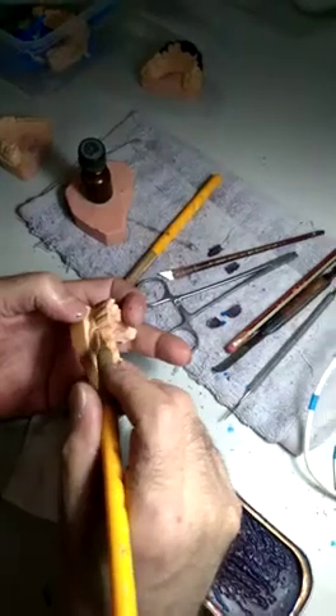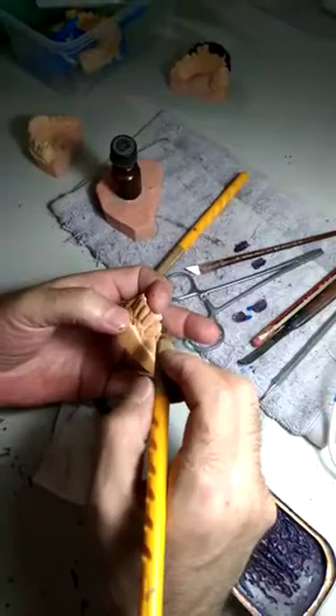At the beginning you make the basic wax, then you make the incisor — for lateral, central, canine, it's the same.